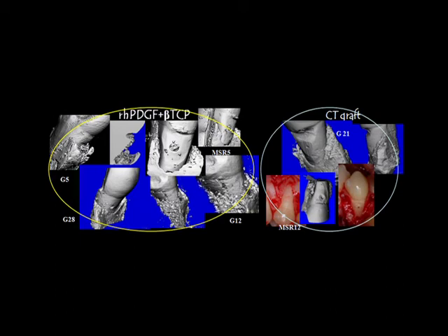I think if you look at all of the activity on the root surface here with the PDGF group, look at all the bone that's growing up over it. Look at these two root surfaces here. Again, this looks exactly like it looked that day. Exactly, and this looks exactly like that.